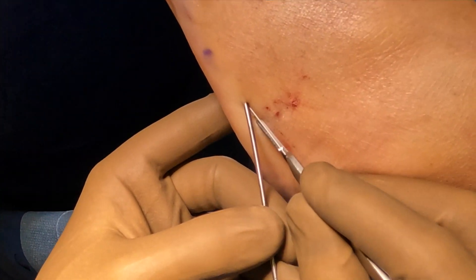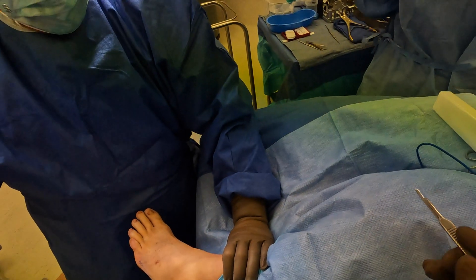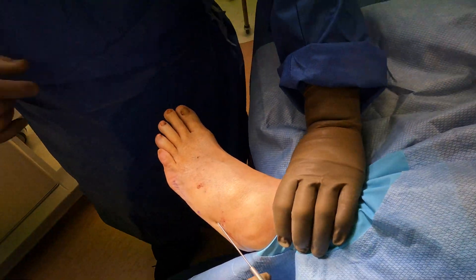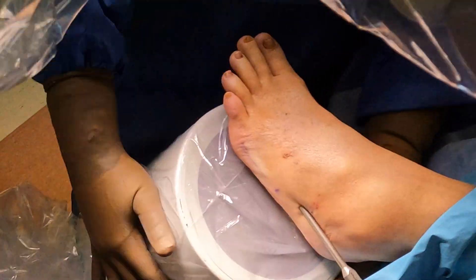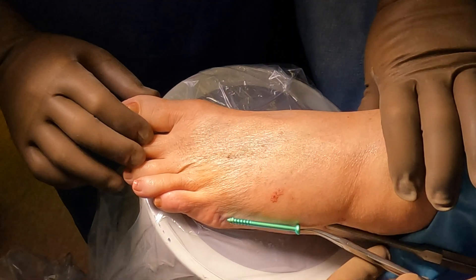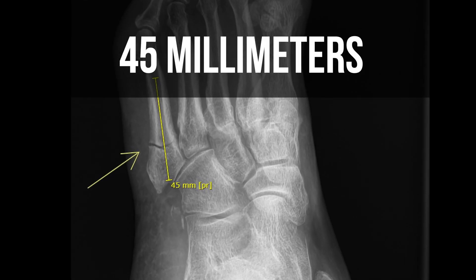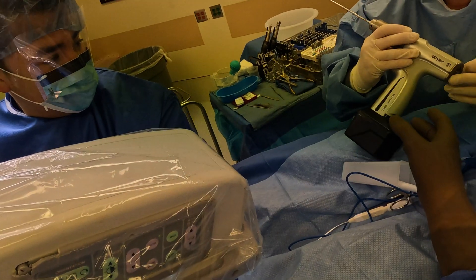We're going to make a small incision and then measure to make sure we have the proper screw length. We take our measuring device, put it up against the bone, and use intraoperative x-ray to confirm adequate length. We also put the screw up against the bone to confirm under x-ray. We measured prior to surgery and found it to be around 45 millimeters, which is the size of the screw we inserted.